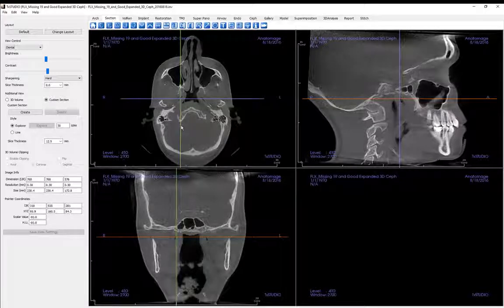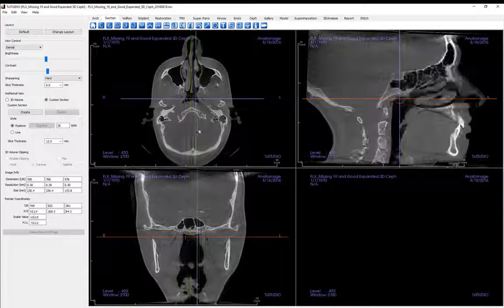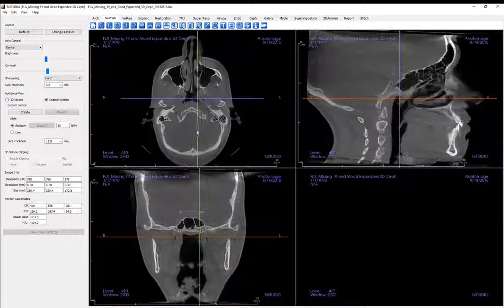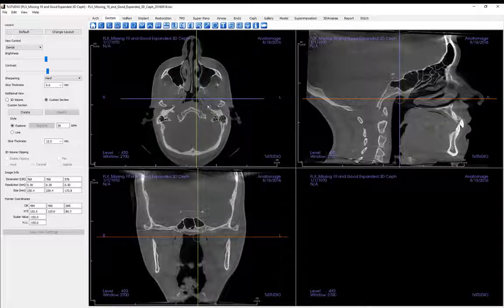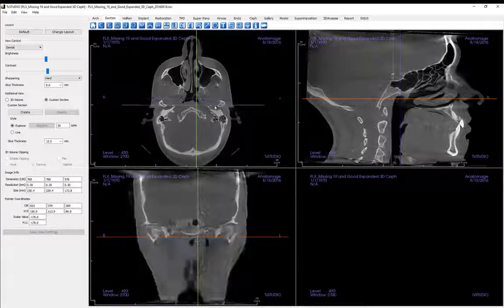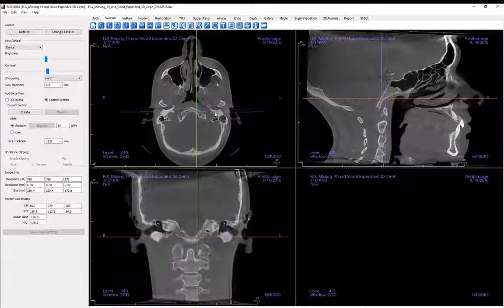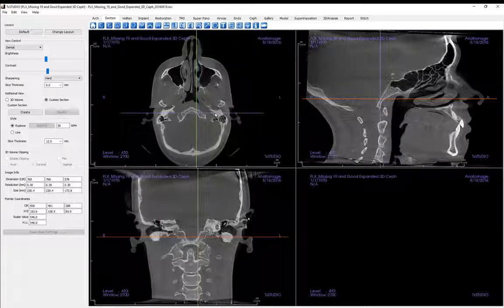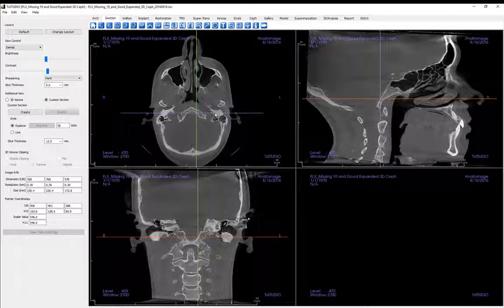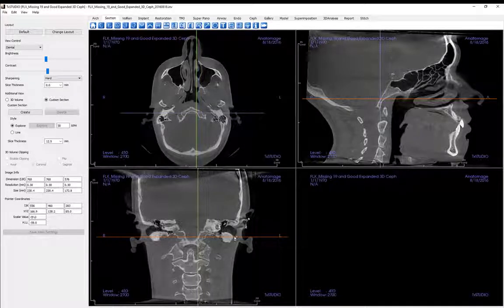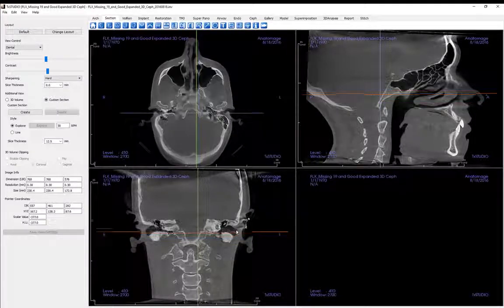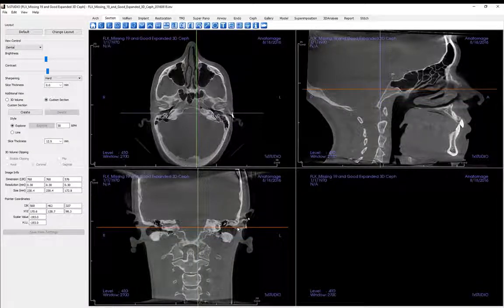Green lines move through the sagittal slices from left to right. Blue lines move through the coronal slices from anterior to posterior. Red lines move through the axial slices inferiorly to superiorly.